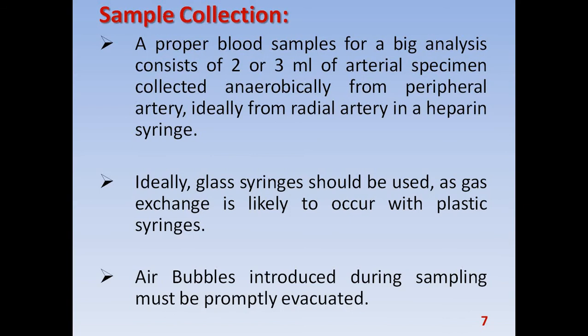It should be done because, let's say the ulnar is compromised, then when we take the sample from the radial artery, and if there is some complication and the blood flow is compromised there also, then the blood supply to the hand will be cut off, and that will be a very serious situation.